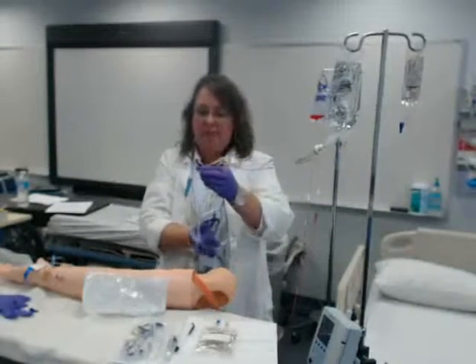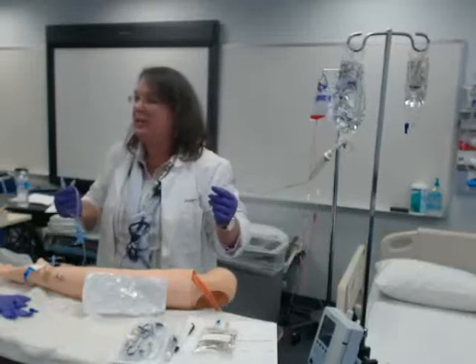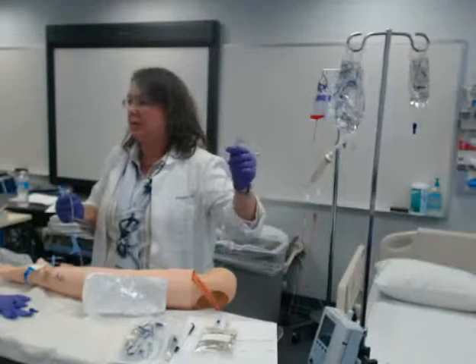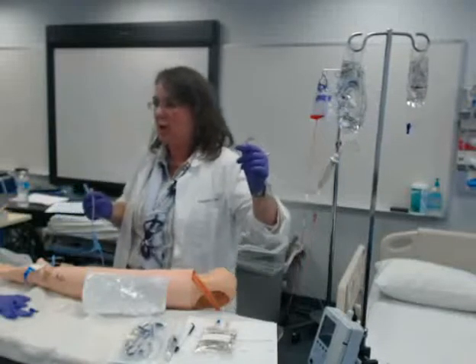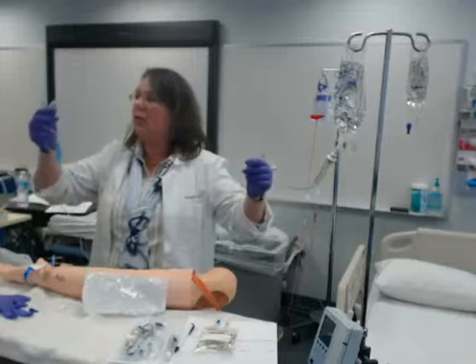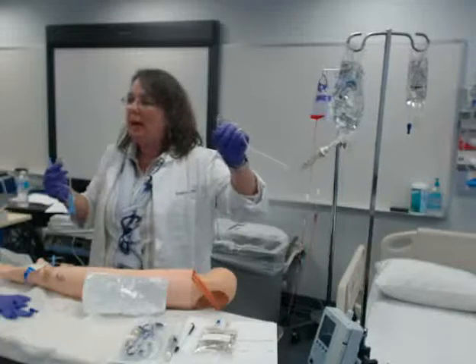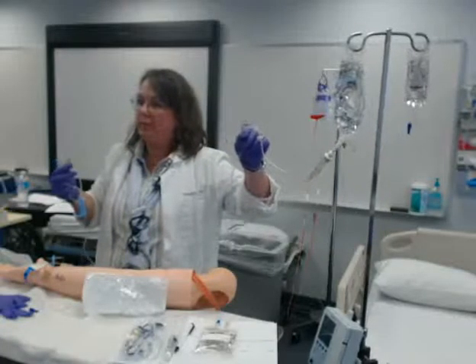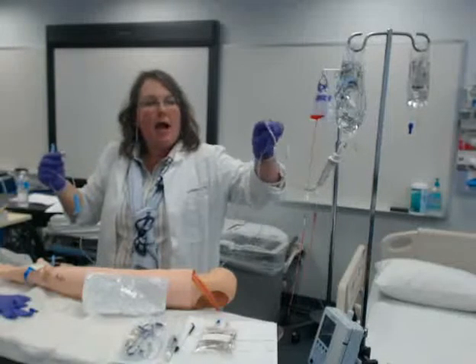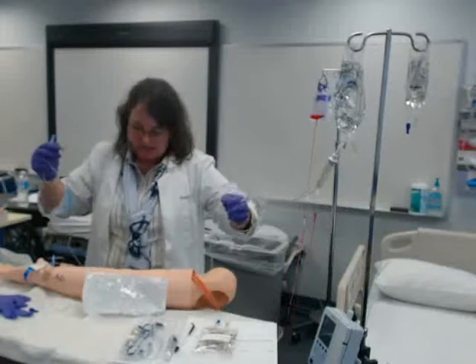Now I need to get all the air out of this line. I want to purge this over a safe place. Some people use the trash can, but I don't have a good trash can. I'm so good that I can actually use my paper. So I'm going to use my paper, and I'm going to slowly open my roller clamp, holding on to the end because I want to make sure it drips into my bag there.